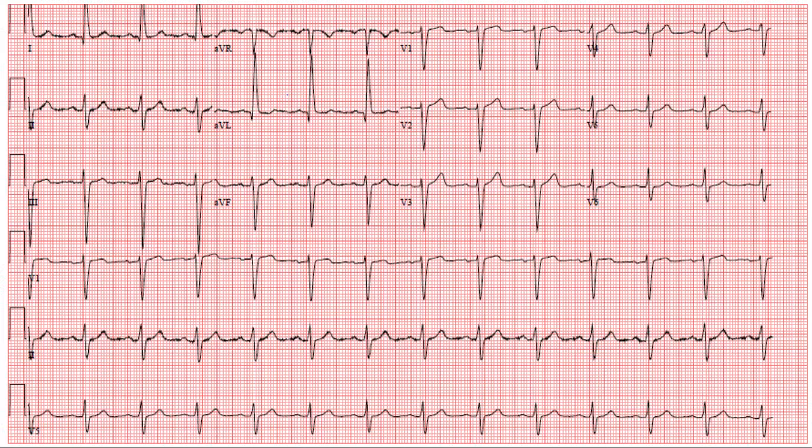I am the Whiteboard Doctor, and today we're going to be talking about a very thrilling topic known as diagnosis of left ventricular hypertrophy on 12-lead EKG.